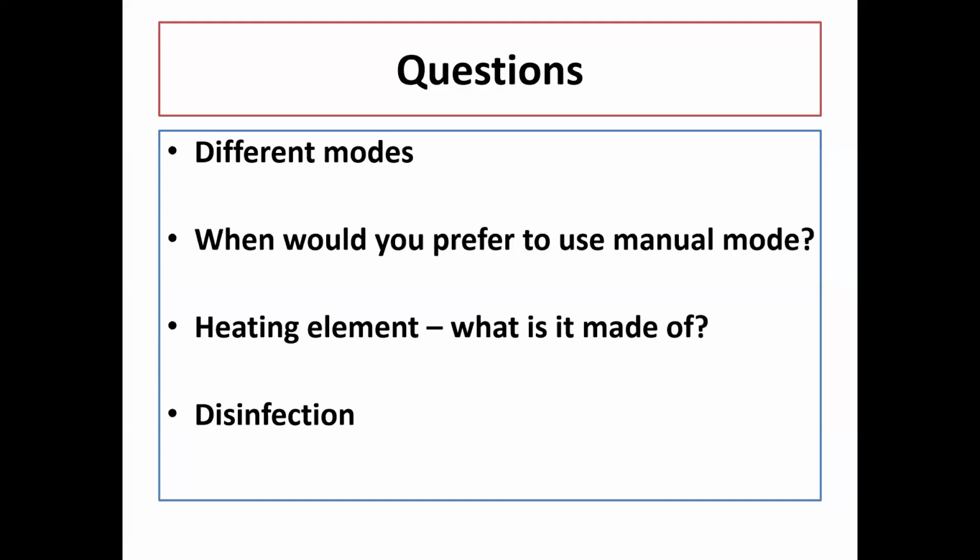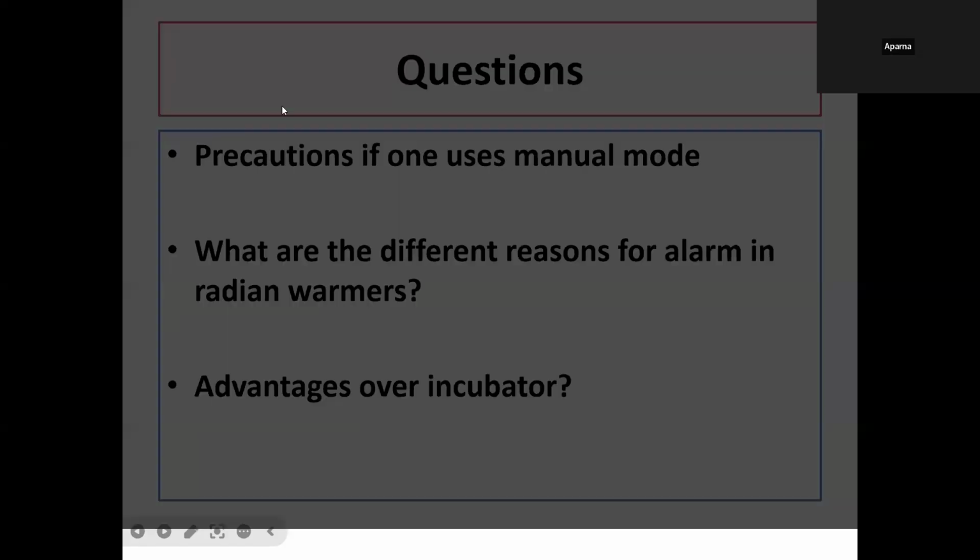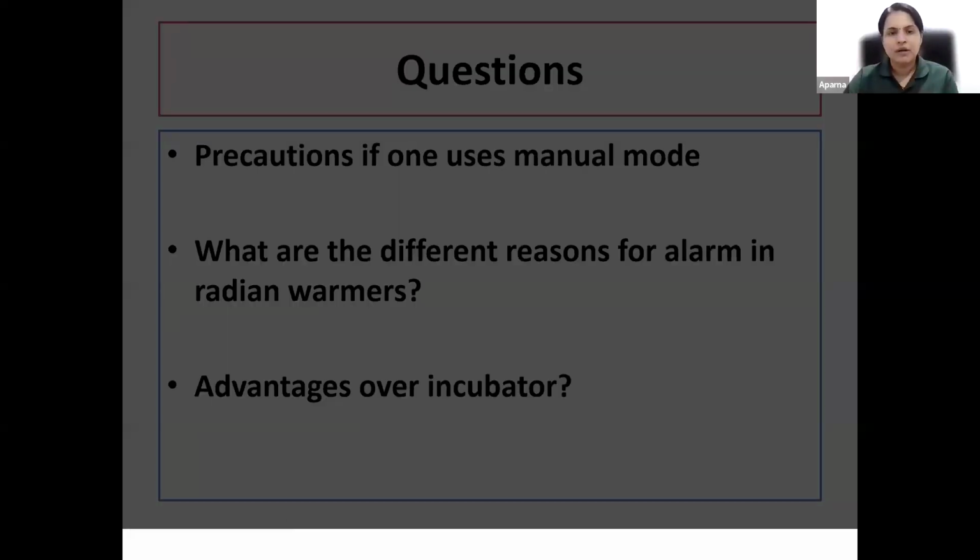Next common question is, how do we disinfect the warmer? While the warmer is in use for a newborn baby, never use any disinfectant solution. Always try to use soap and water for cleaning the warmer surface. Whereas when the warmer is no longer in use, there are different ways for cleaning the warmer. We can either use wipes that are made from bacillol, or we can use bacillol solution as a spray. We also use quaternary ammonium chloride compounds for sterilizing the warmer. So these are all different modes for cleaning the warmer. It's important to avoid using alcohol over the warmer displays because this can lead to damage to the display boards.